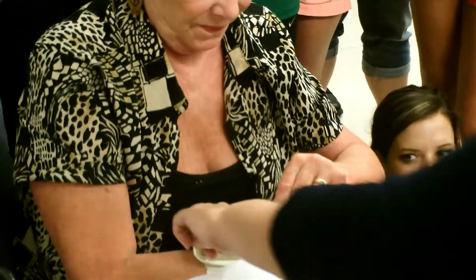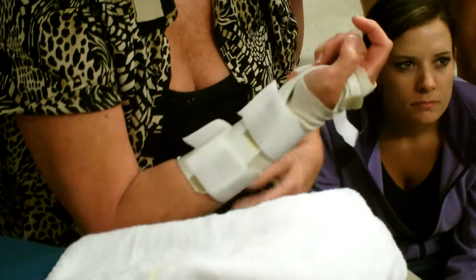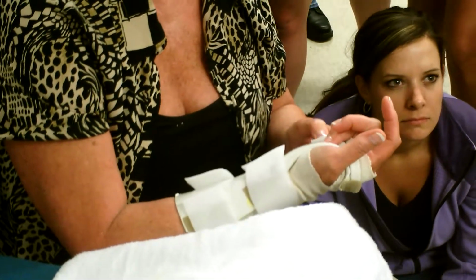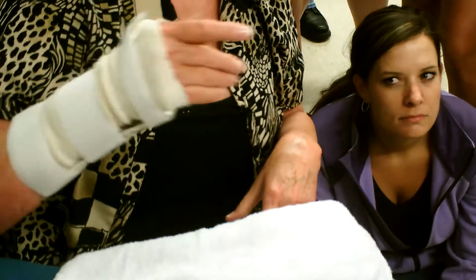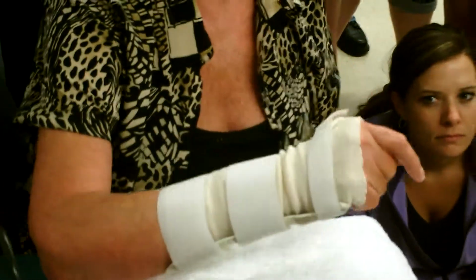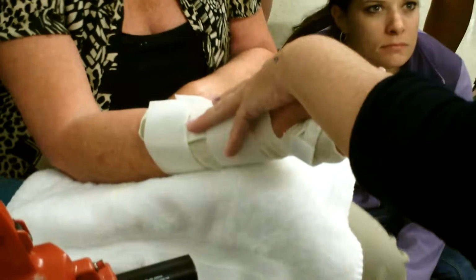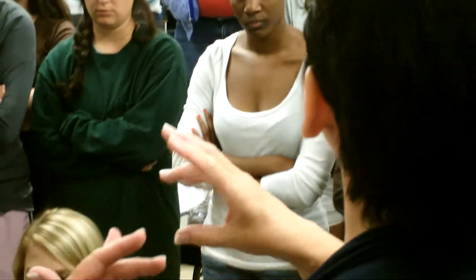You always want to make sure that the Velcro is not exposed because like a jersey knit sweater, if I get the Velcro on it, and the first time I get a pull in my sweater, I'm not wearing this. So you want to make your splint as friendly as possible so the person's going to be compliant. Okay? So I'm going to have her sit for a few minutes. I'm going to give her instructions.